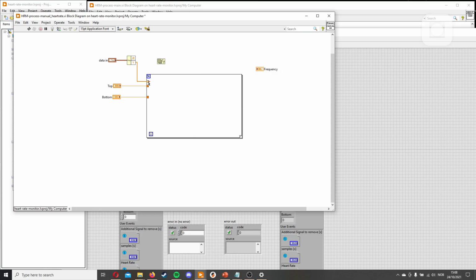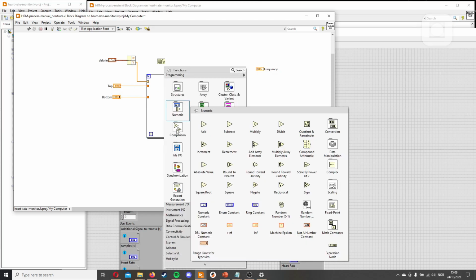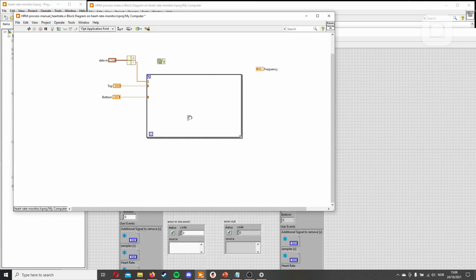Now with this one, it will iterate over every y value, since we have nothing connected here and this is the only array. First, we want to know, let's start at the beginning. We want to know when this has passed the top value. And when it has passed the top value, we get a true out here. But as I explained earlier, just having the top value means it could pass it multiple times without ever going down, and that would not indicate a heartbeat.